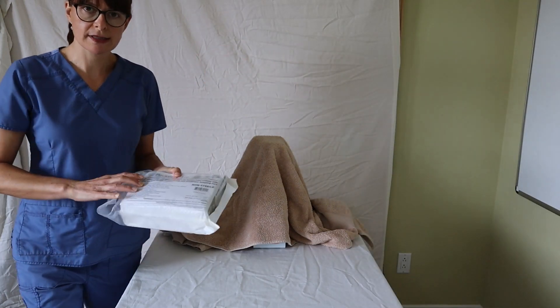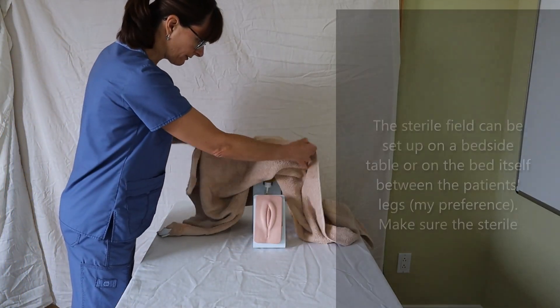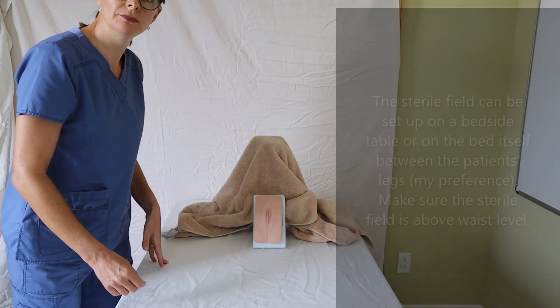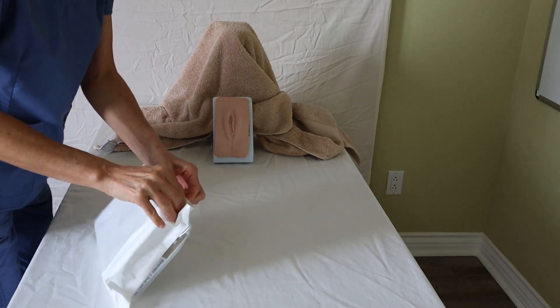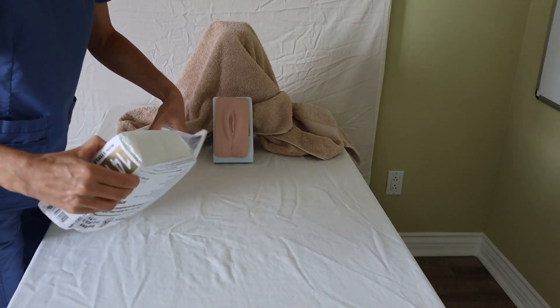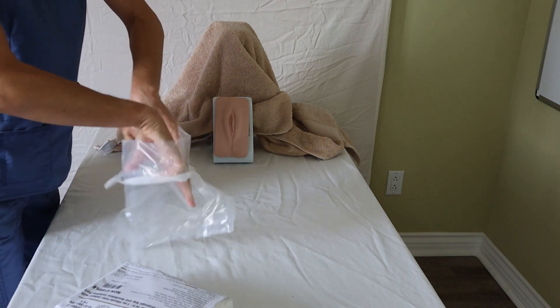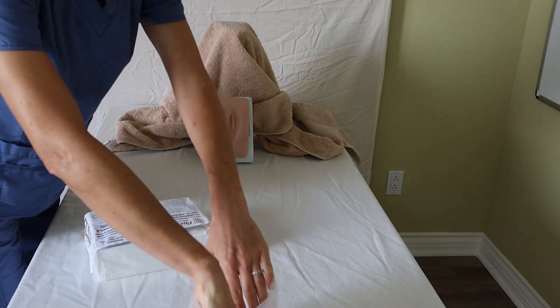So let's say we've already done peri care on our patient. I'm going to set up my sterile field now. After providing hand hygiene, I open up the catheterization kit package, and I can actually use the plastic bag it comes with as a trash bag that I will keep handy at the bottom of the bed.